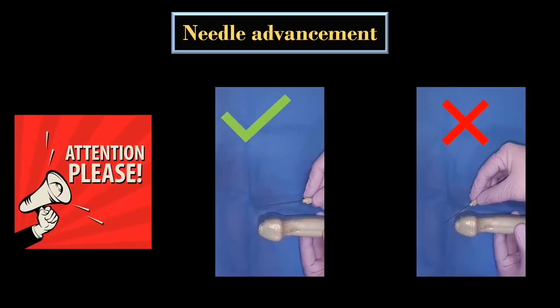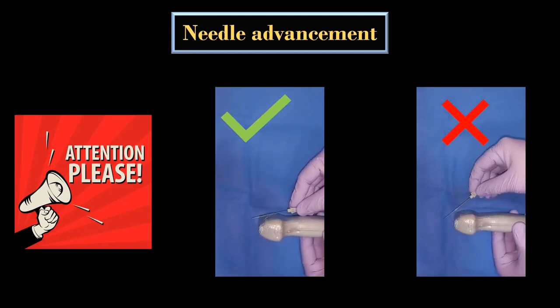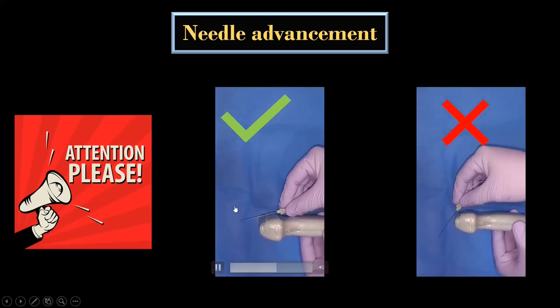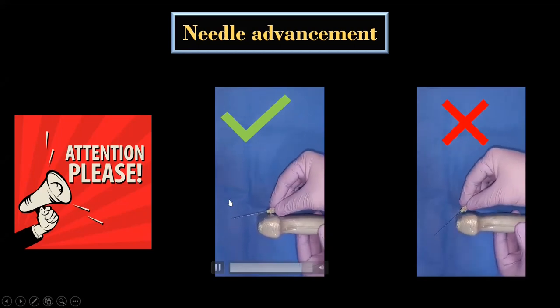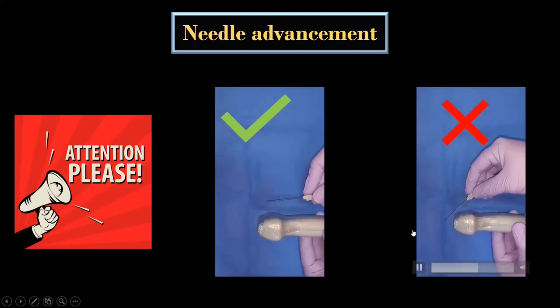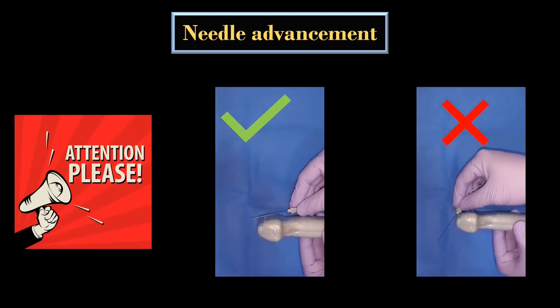The needling technique plays an important role in safe performance of this technique. If a proper insonation angle is maintained, it will be possible to visually align the needle pathway. The rest of the possible complications I have already discussed in my previous video.